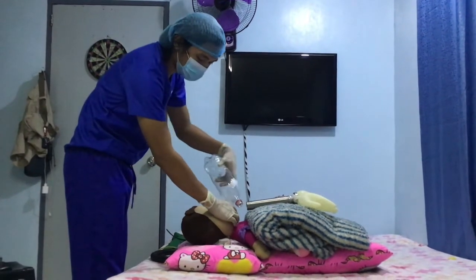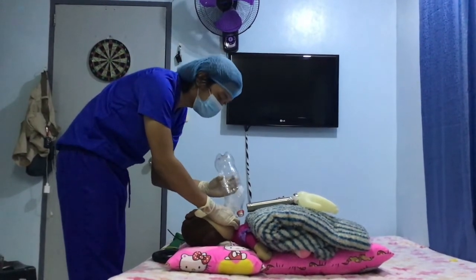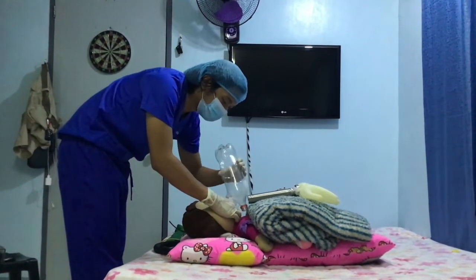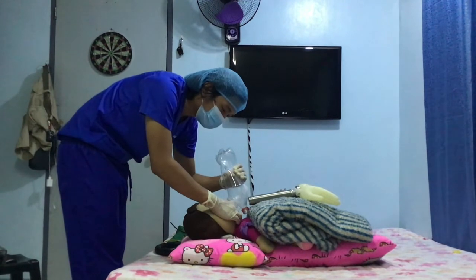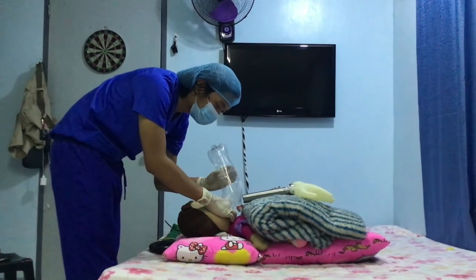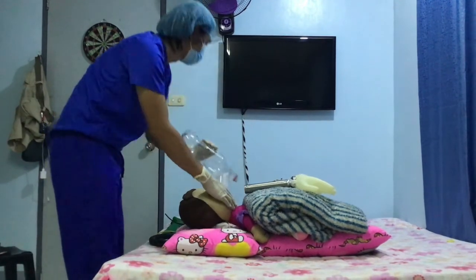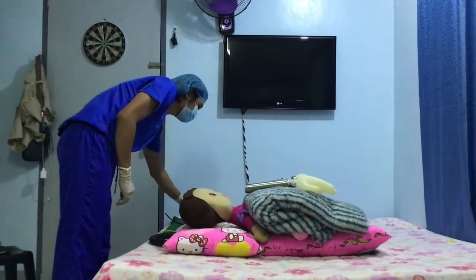Use the C-E hand grip. Ensure a tight seal. Manually bag with your right hand. Oropharyngeal airway may facilitate airway patency in case of airway obstruction. Propofol and succinylcholine are then administered IV.